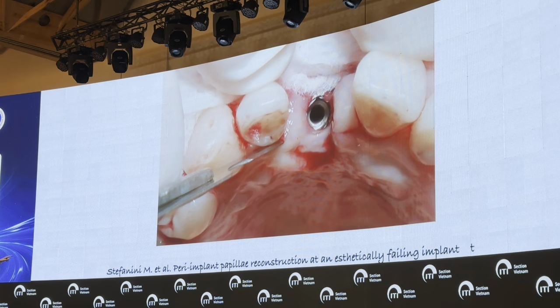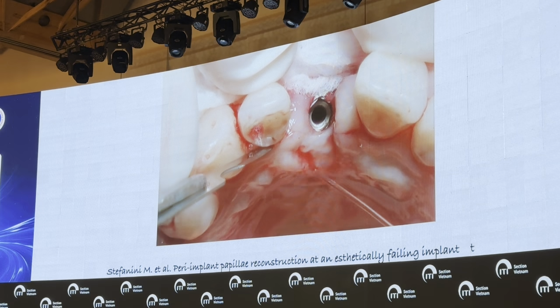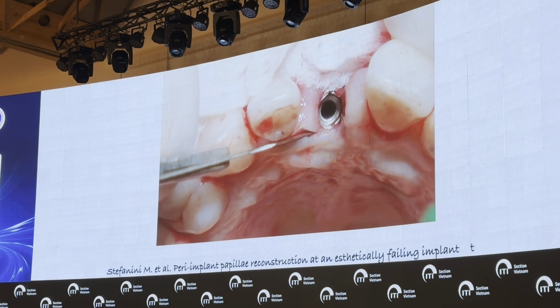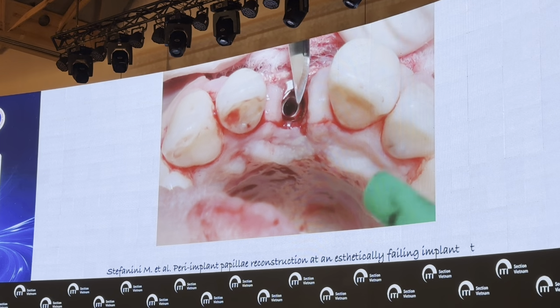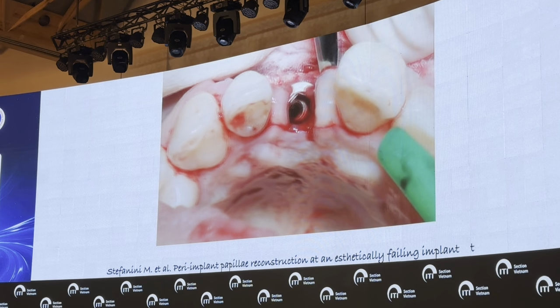Now I can start performing the second incision on the palatal aspect, connecting line angle with line angle and delimiting the occlusal platform that in a real edentulous area is completely made of epithelium and connective tissue.